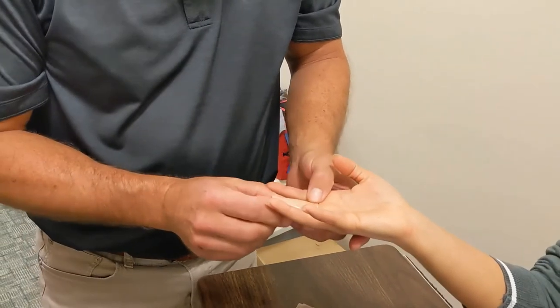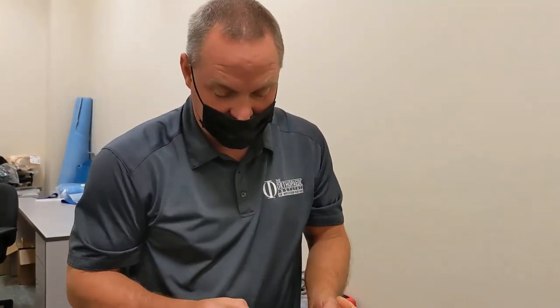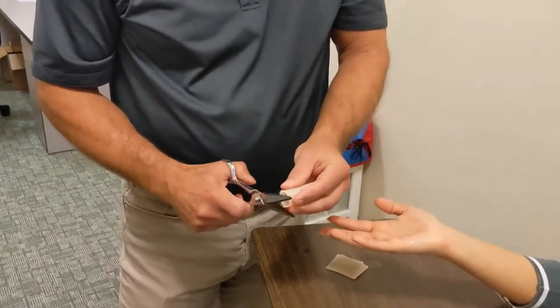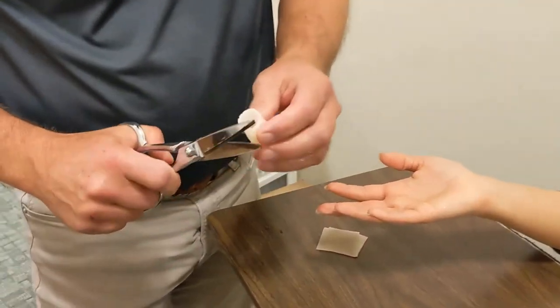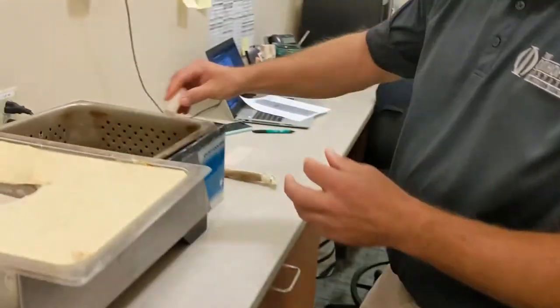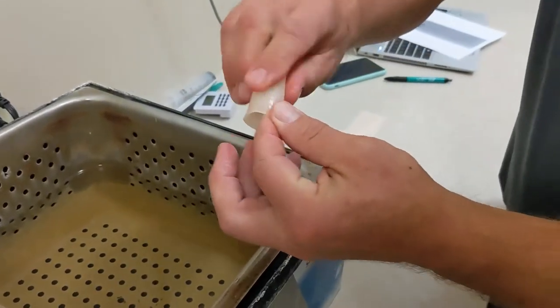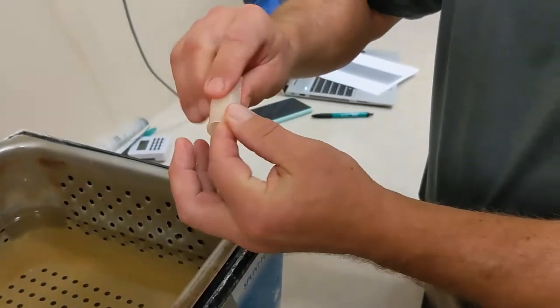You can see as it cools, it turns back to the beige tan color that it was. I can slide it off now. Remove the sharp edges, and I smoothed up the ends so it'll be more comfortable for the patient.